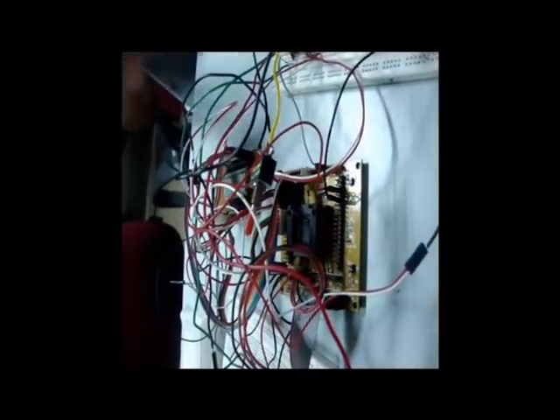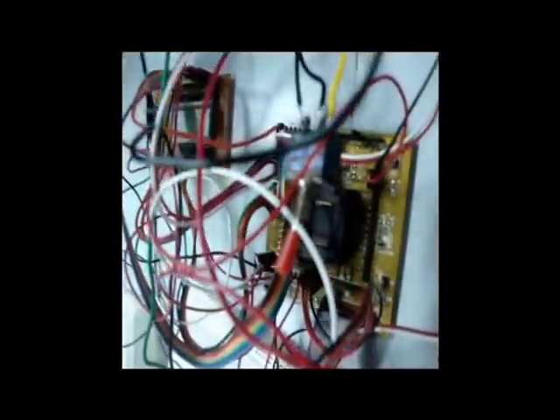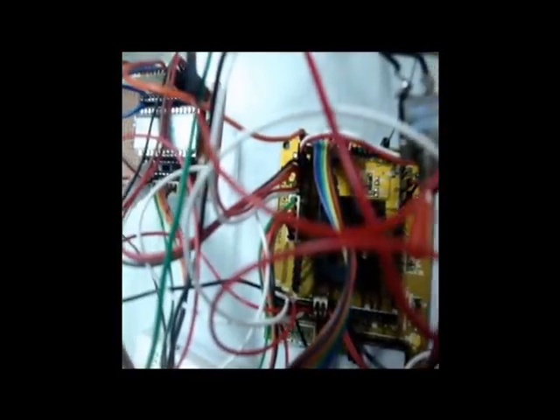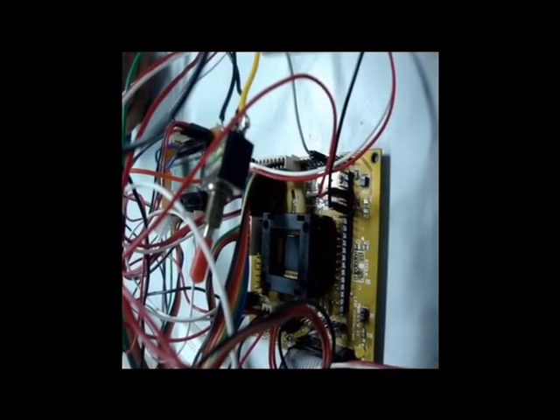Considering the first microcontroller, the MSP430FG439, the timer is running on a clock that utilizes a 32 kHz external crystal for its operation. The 12-bit ADC of this microcontroller is configured to sample in a single channel repeat sequence mode.